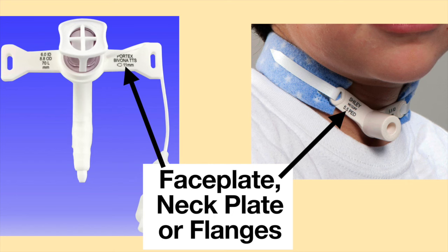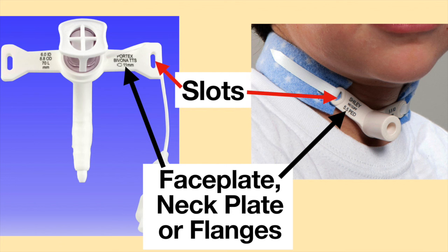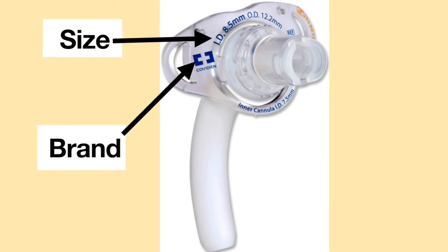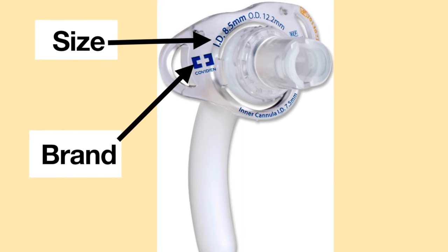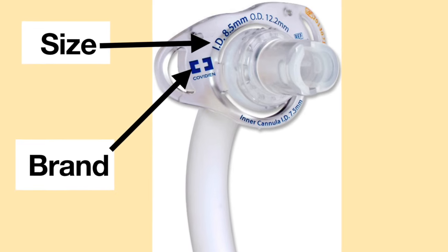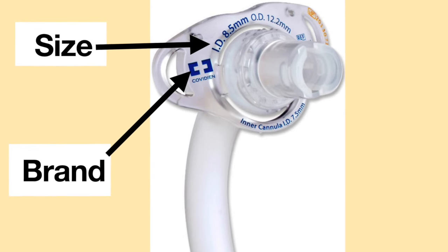The part of the tracheostomy tube which rests on the neck is called the face plate, neck plate, or the flanges. This part has slots in it where the tracheostomy tube ties or holder attaches. Many tracheostomy tubes have printed on the face plate, neck plate, or flanges information about the tracheostomy tube such as the size and brand.